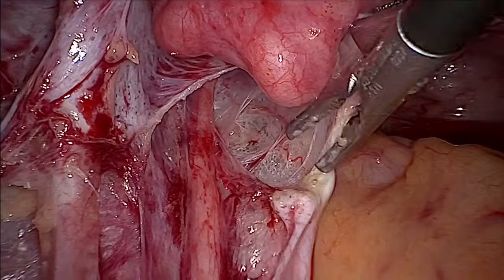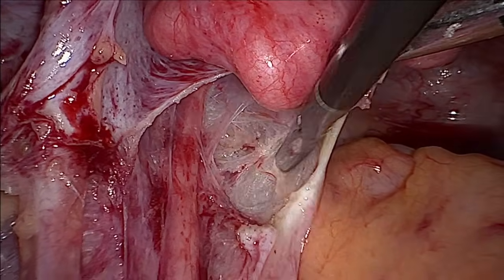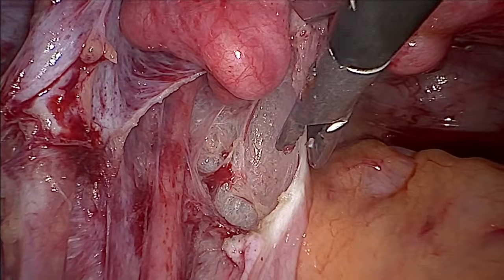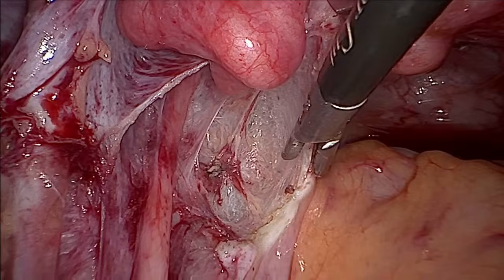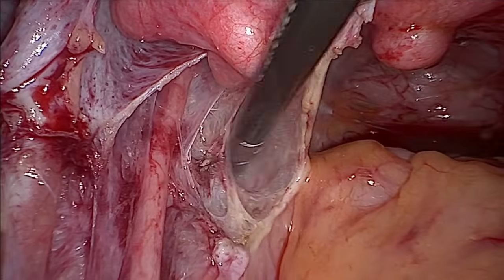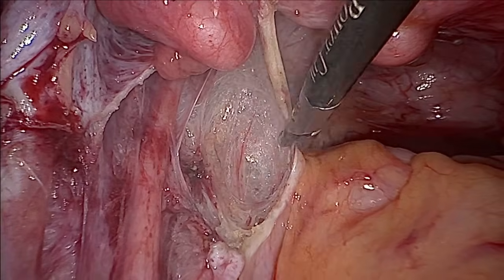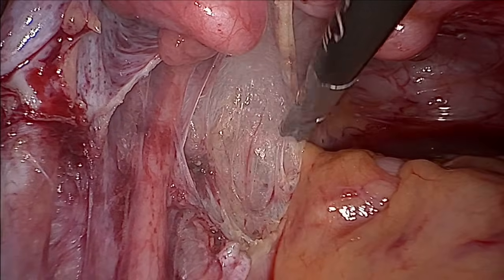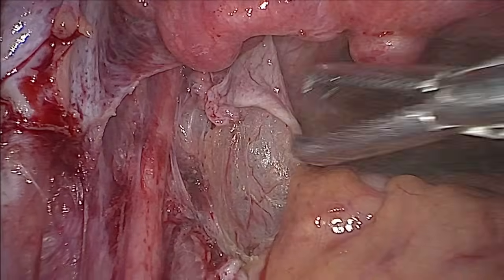So this is in the previous live surgery which we did today. This is called opening up of the pararectal space. Okay, so this we are opening. You can see the pararectal space opening here. Now we have lateralized the ureter further.